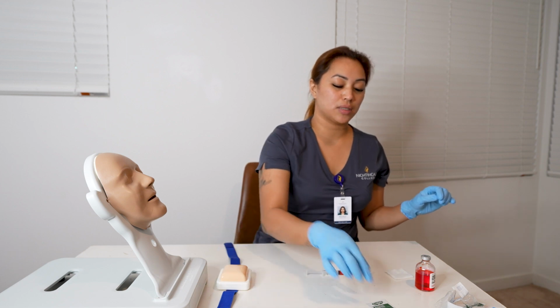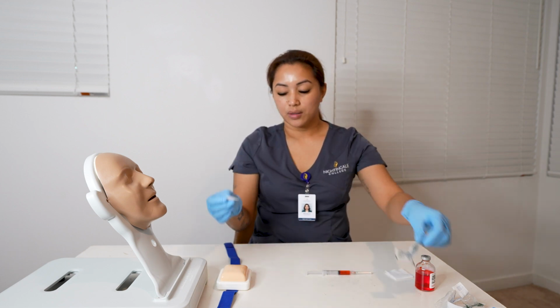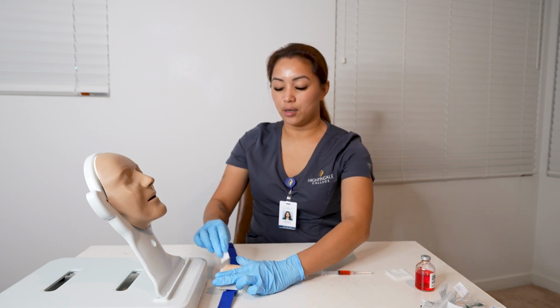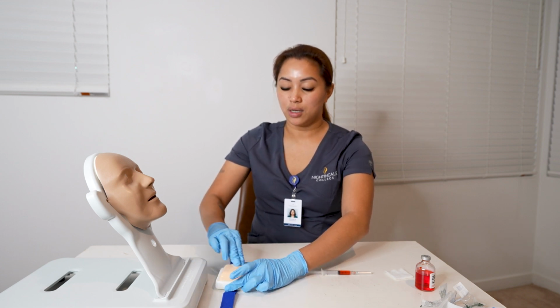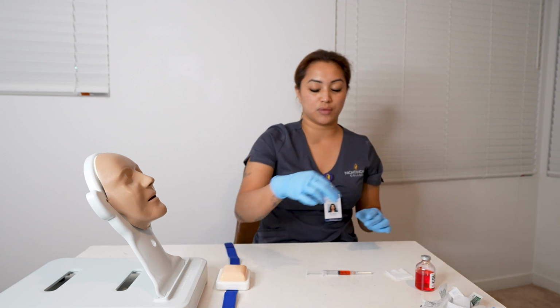So now we are going to prepare her skin with the alcohol swabs. Now we are going to clean the site, 2 fingers down right here. So this would be her deltoid just in the middle. So in the middle, we are going to do a circular motion, outer just 2 inches away. Perfect. All right, so now we're going to dispose of that.